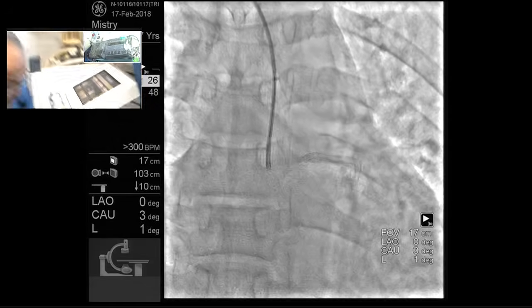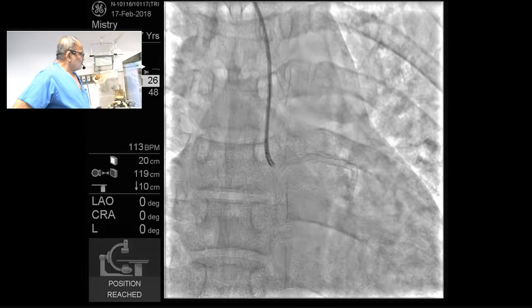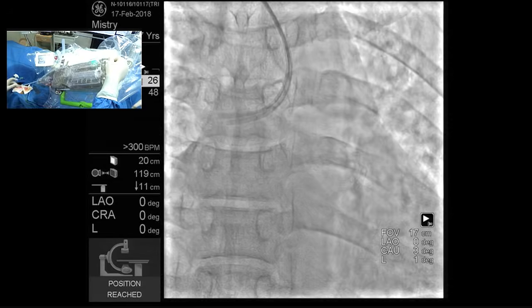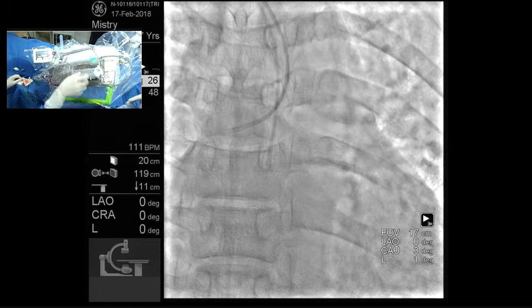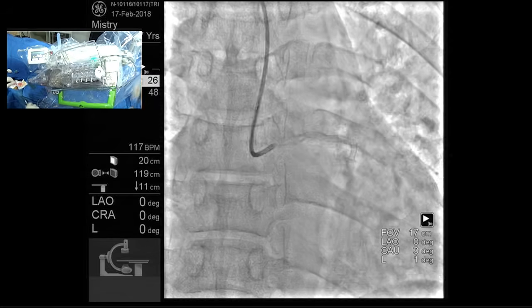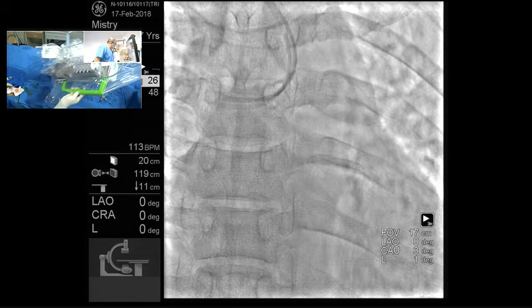Right. So any questions you guys have? Yes, Dr. Patel, this is a nice representation of robotic angioplasty. I have a few questions. You are doing these procedures with the remote control, and the knobs are quite large in size, while the wire and balloon are low profile things.